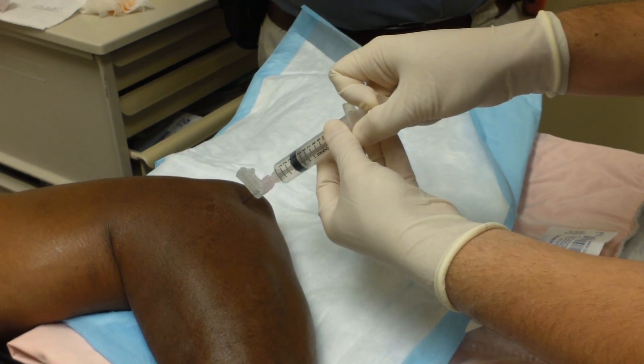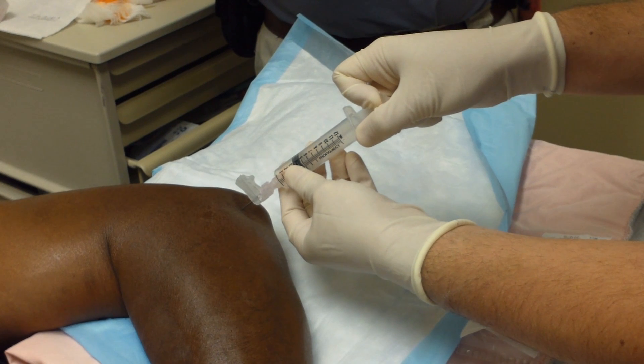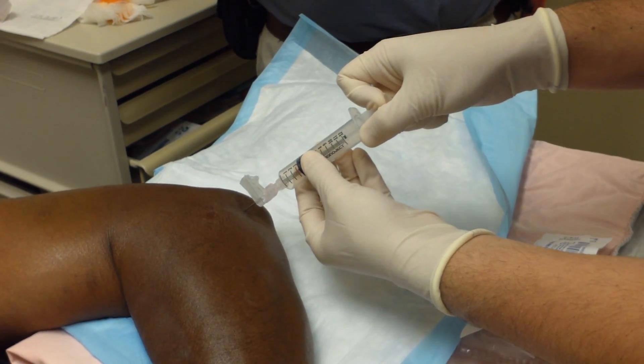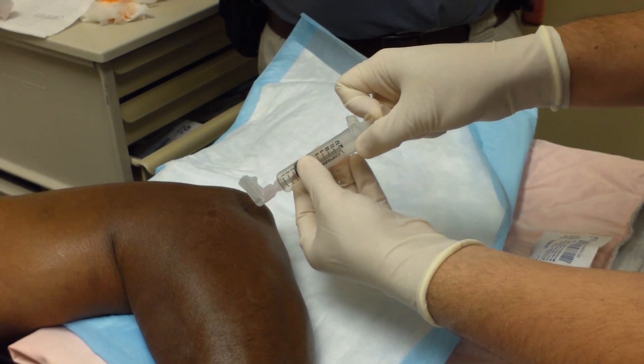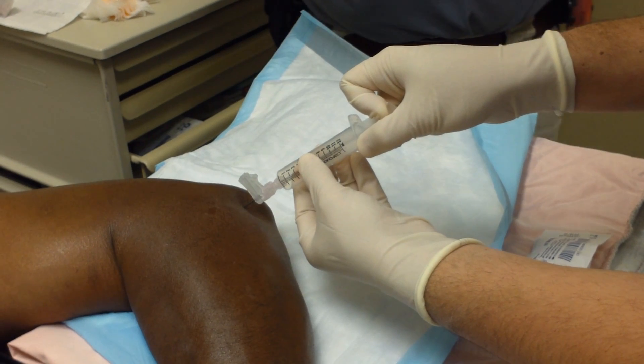It's kind of a dry tap, but you just have to march the needle until you find it. Is that hurting? No pain? No pain — I don't feel anything. Good, he did a nice job of anesthesia.